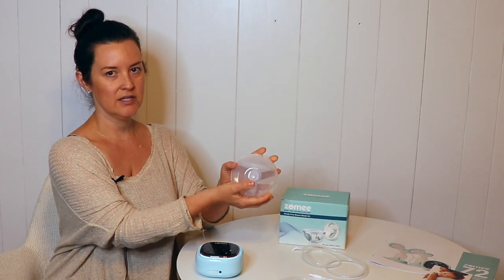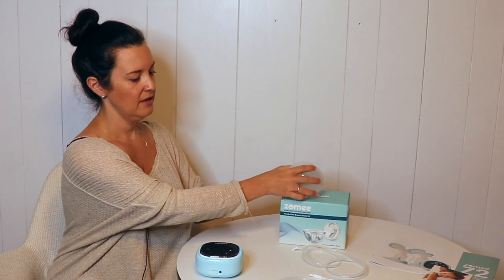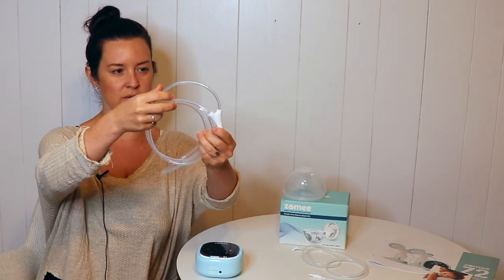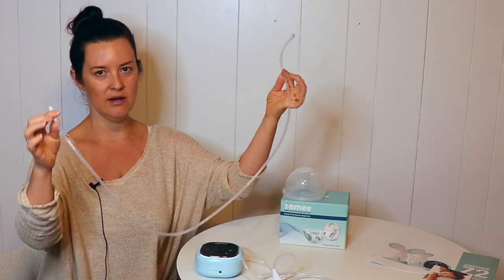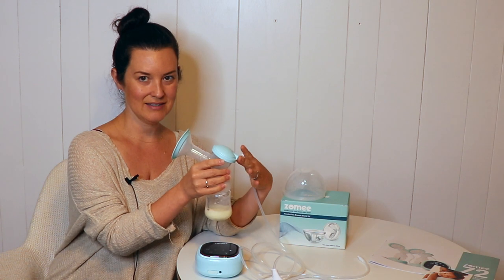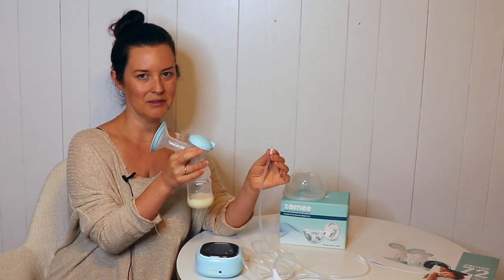You have the collection cup with all its parts — I'm going to break that down for you in a moment. And we have two sets of tubing: a Y tubing so that you can pump on both sides, and a single-sided tube for single-sided pumping. Important to note that this tubing is slightly different than the tubing that connects to the bottles that come with the pump — the connection is a little bit different.